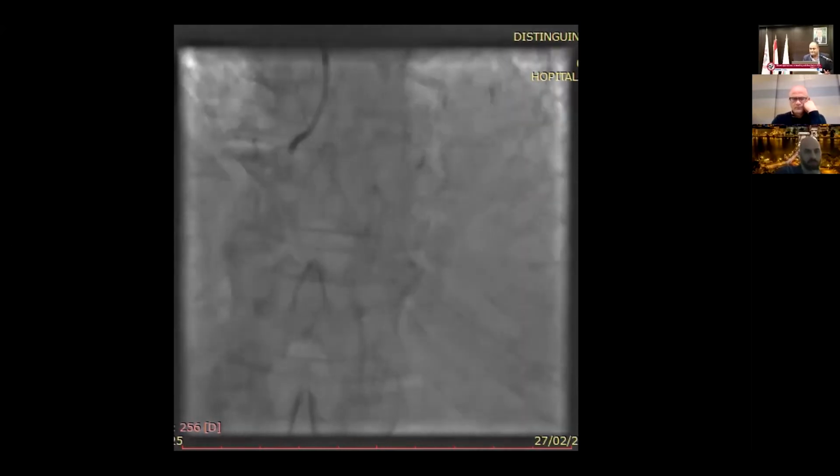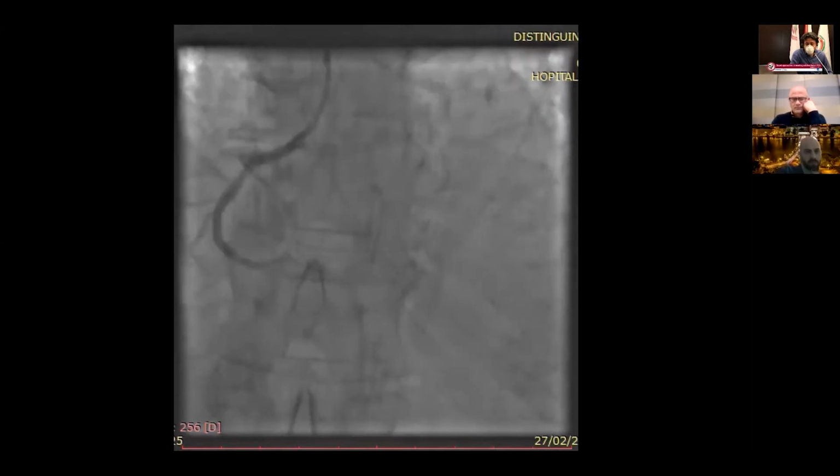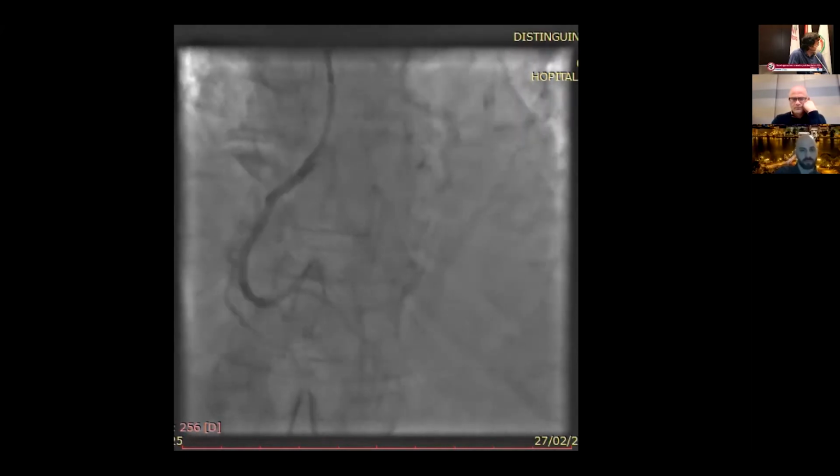Dr. Rati, I want to ask you, after rotablation, you need a mother and child to cross the stent? Yes. Even after the rotablator? Because I have very weak support, although I use the AL 0.75. This is the support.